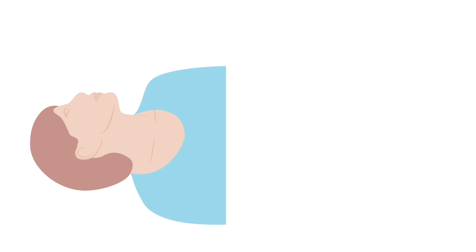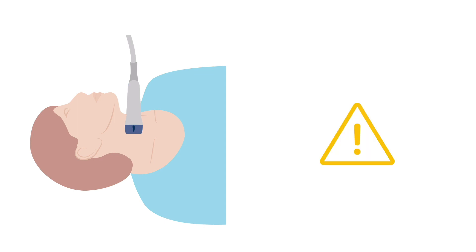The first step is to scan the right side of the patient's neck. Using a good amount of gel, position the probe on the patient's neck. Be careful not to exert too much pressure, particularly around the bifurcation where the vessels are very close to the skin and can easily be compressed.